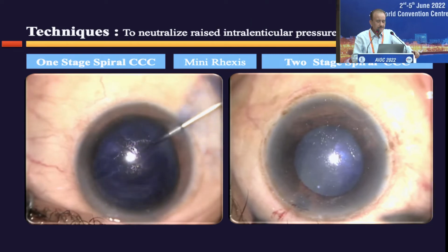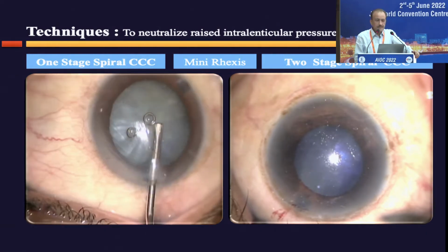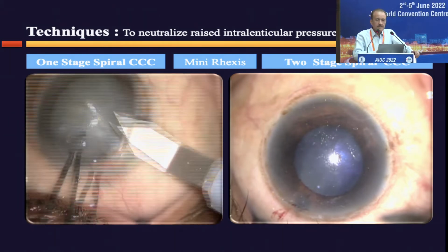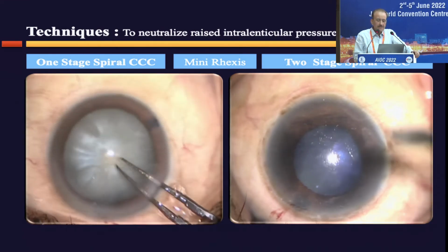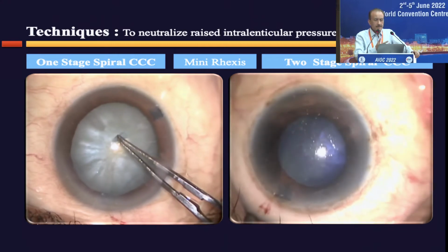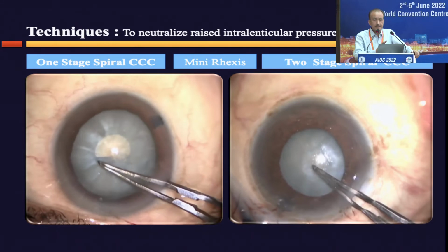been knowing this one-stage spiral capsulorhexis we started with in the beginning. But actually, all these techniques, whether you call it one-stage spiral rhexis, two-stage spiral rhexis, or mini rhexis, work well if the capsular intralenticular pressure is within the optimum range of extension.